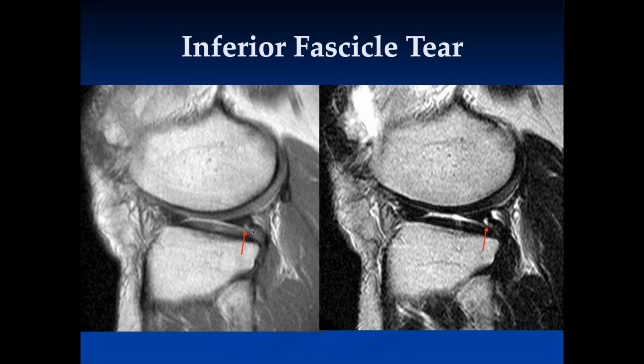I don't think I know how to treat this. I don't either. I'm sure there's somebody who would like to put a stitch in it, but I don't know that. For this little tiny thing, I don't know, John.